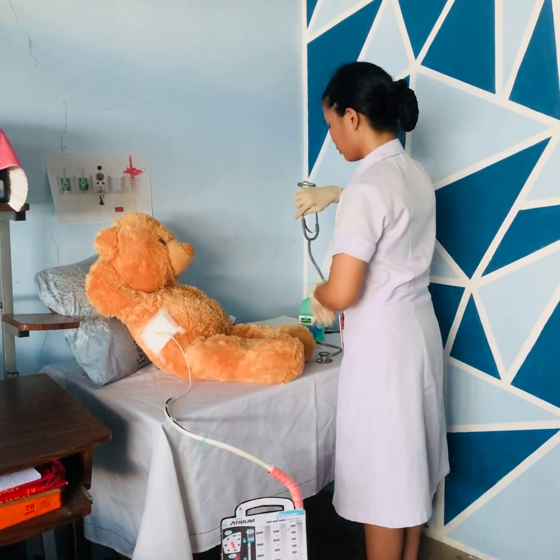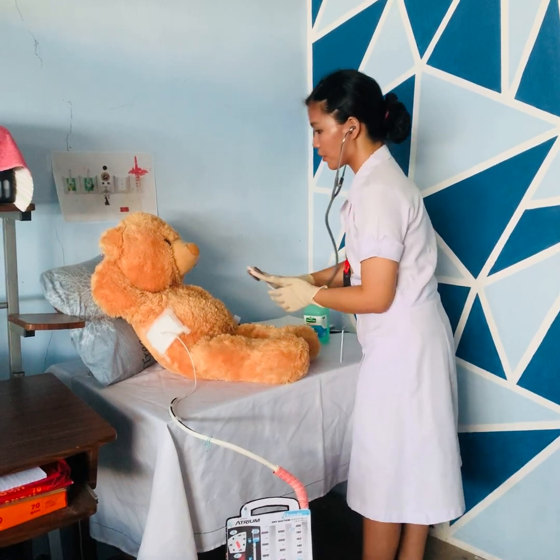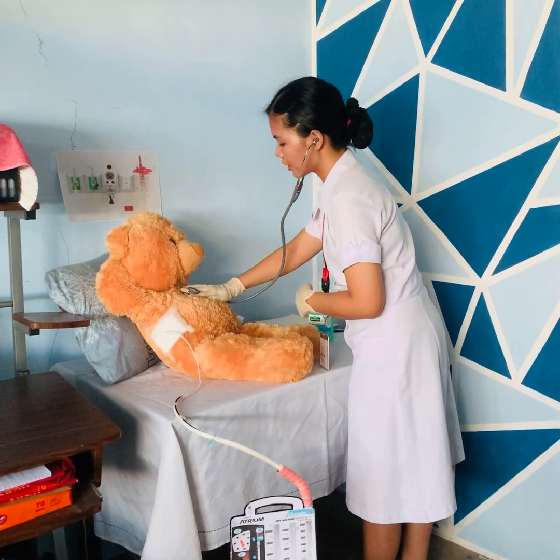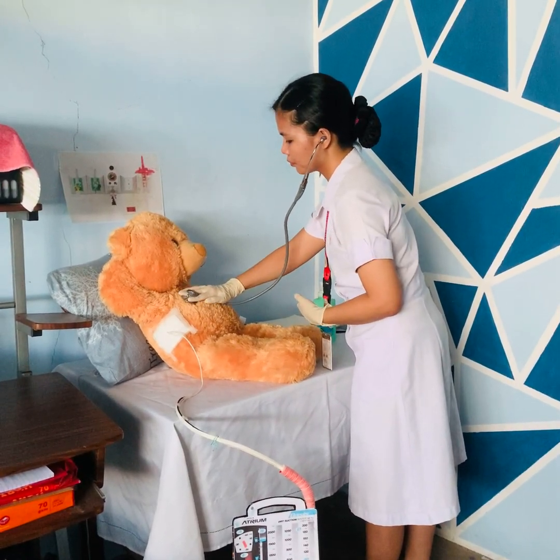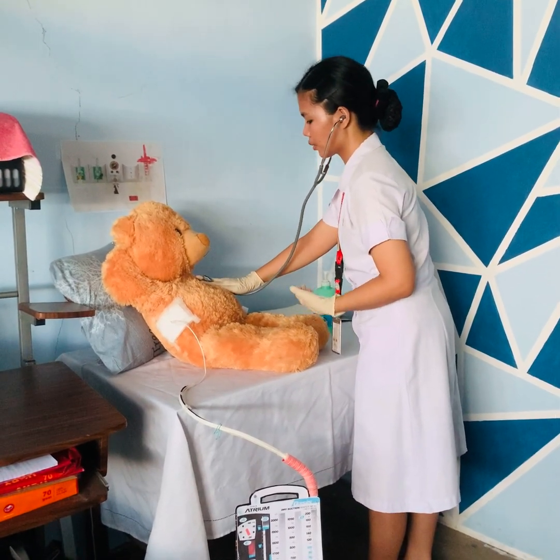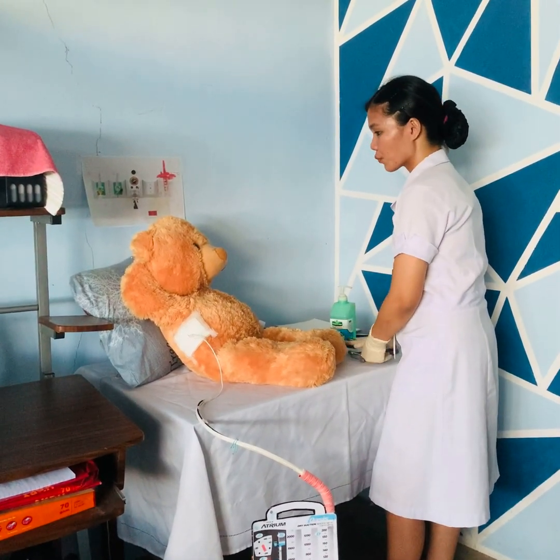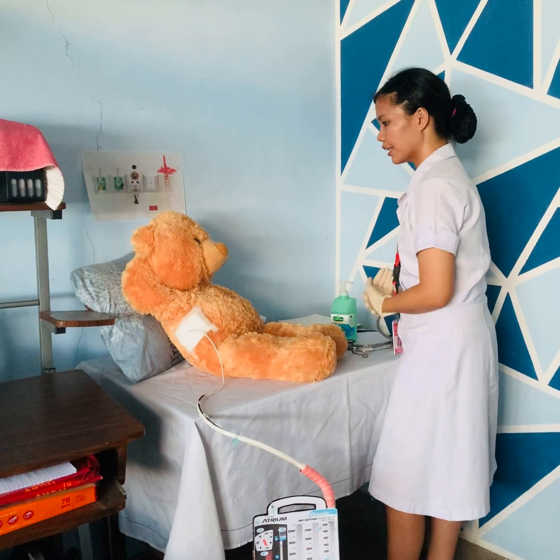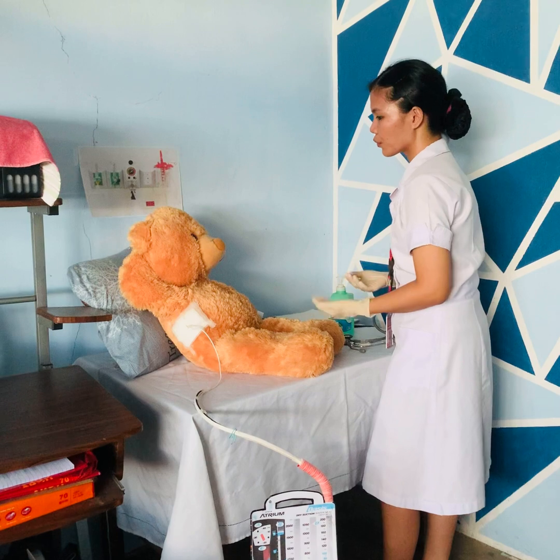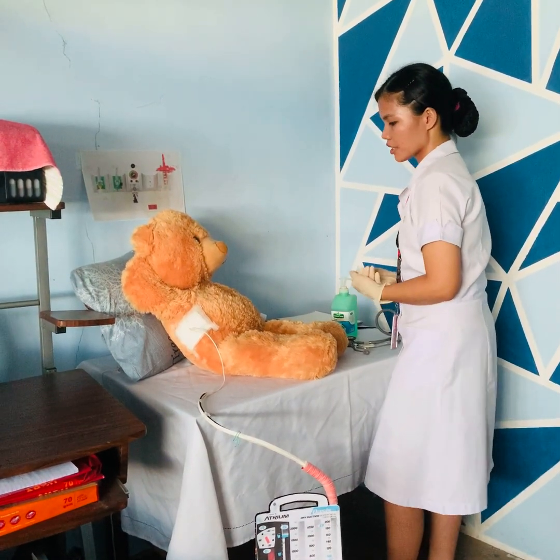Do you feel or experience any pain right now, sir? Can you rate your pain on a scale of 0 to 10?